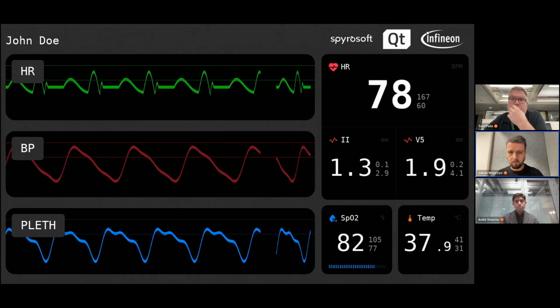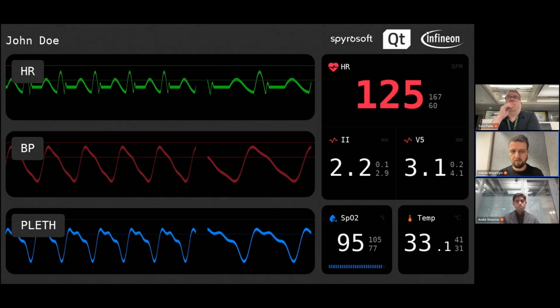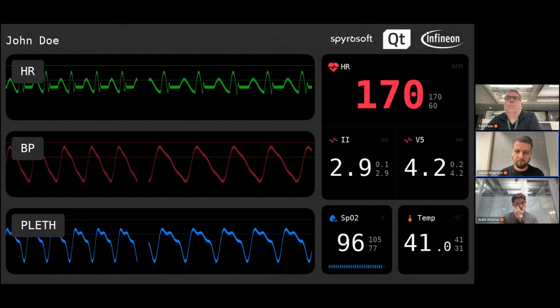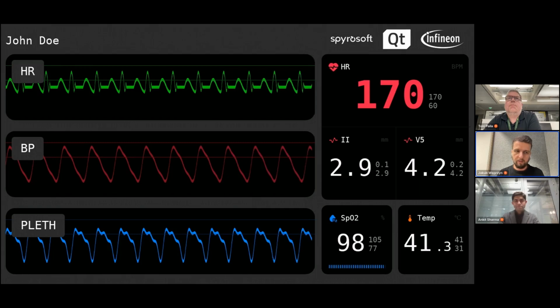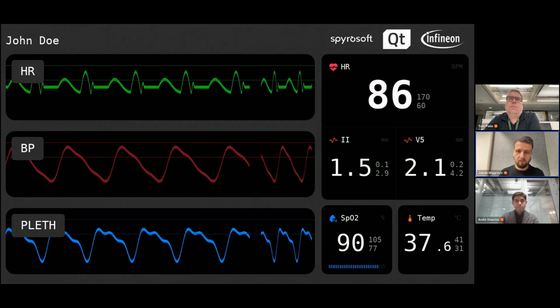So you can see the usual graphs for monitoring the history of different parameters. In this case, those values are simulated, but there's nothing stopping us from connecting external sensors and making a full-featured product based on this demo application.